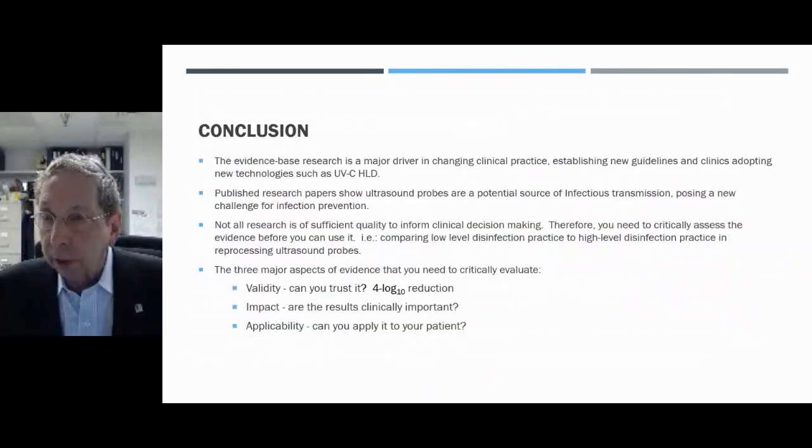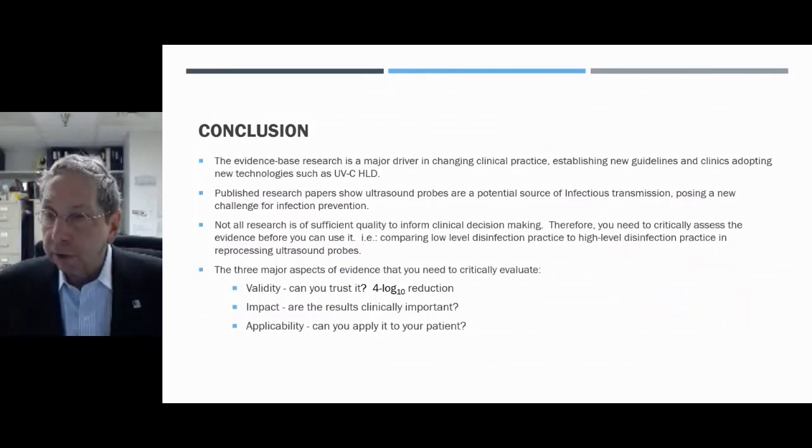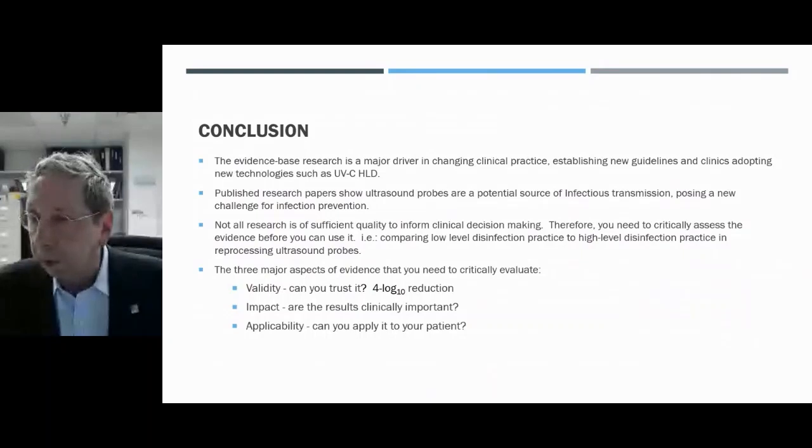So in conclusion, evidence-based research is a major driver in changing clinical practice. And as I've already showed you, the guidelines as well as the clinical data suggest the need for cleaning, high-level disinfection, and probe covers. And there is substantial evidence that this benefits the patient. Not all research is of sufficient quality to inform clinical decision-making. You need to critically assess the evidence before you can use it, although the guidelines help you with that by having experts assess that information.